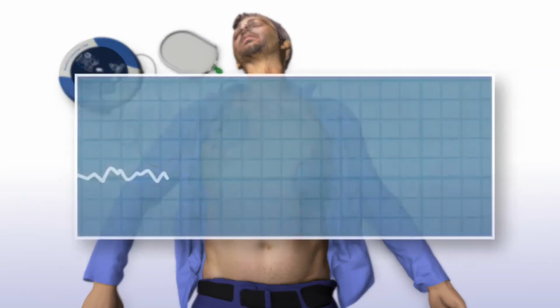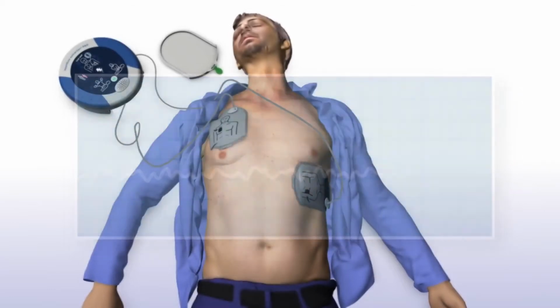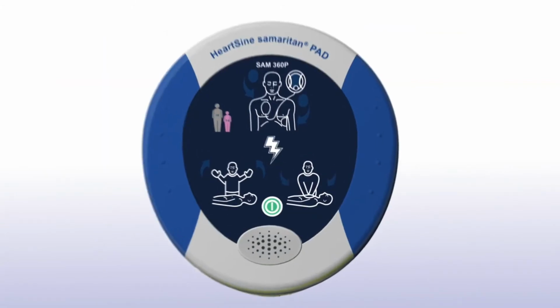The Samaritan PAD automatically assesses the patient's heart rhythm. Assessing heart rhythm. Do not touch the patient. It will automatically deliver a shock if needed. Stand clear of patient. Shock advised. Stand clear of patient. Shock will be delivered in 3, 2, 1. Shock delivered. When performing CPR, it's important to apply effective chest compressions for each 2-minute cycle as directed.